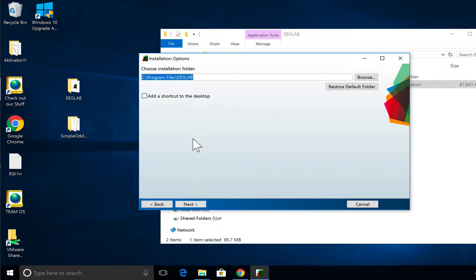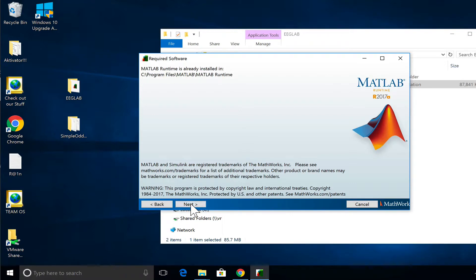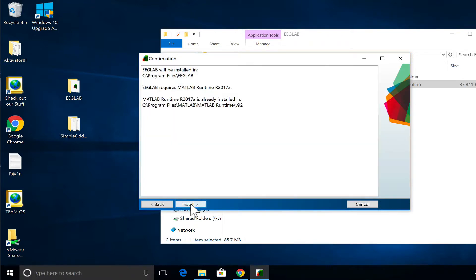Pressing next. Then it asks where you want to install it — the default location is fine. Don't add a shortcut to the desktop and I will explain why later. There are some more disclaimers and a summary of what the program is going to do. It takes about 40 minutes to an hour just to download all the files to execute EEGLAB.